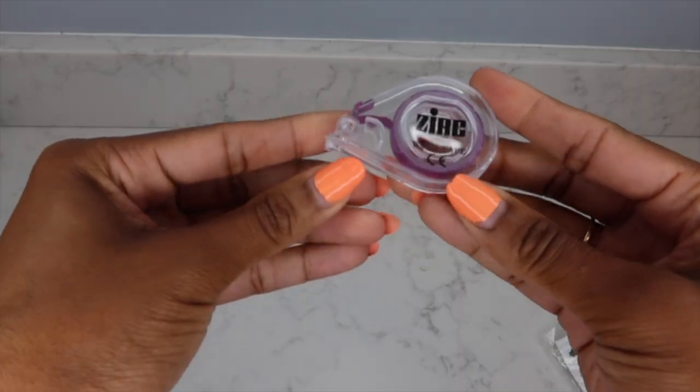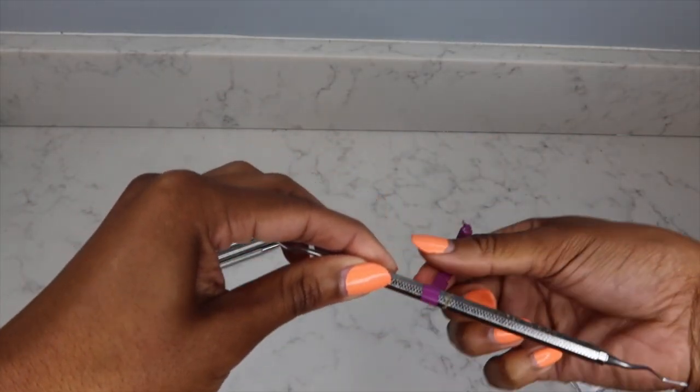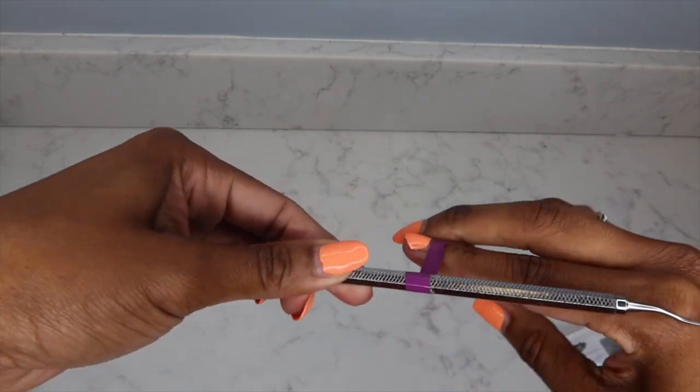Of course the 1/2 for anterior root planing and subgingival deposits. My favorite universal for all over the mouth is the Barnhart 5/6 — absolutely have to have that, cannot live without it. Those are the ones I love to keep in my kit. Also, if you're in an office where multiple hygienists autoclave and store instruments together, I highly recommend getting some color-coded rubber bands or ID tape to wrap around your instruments.